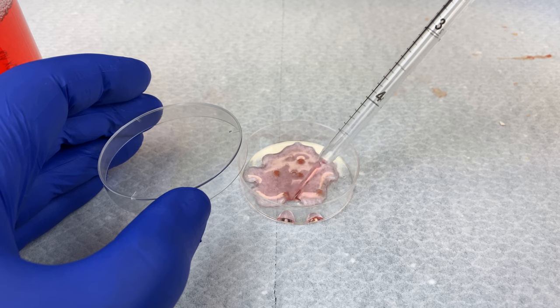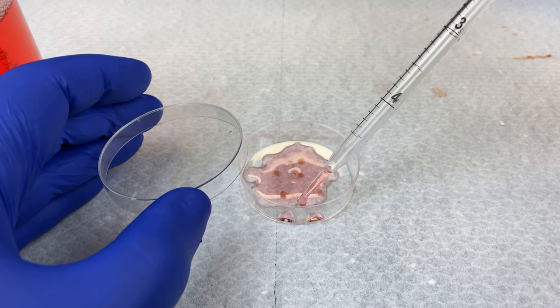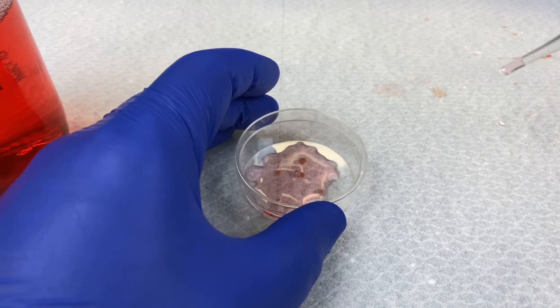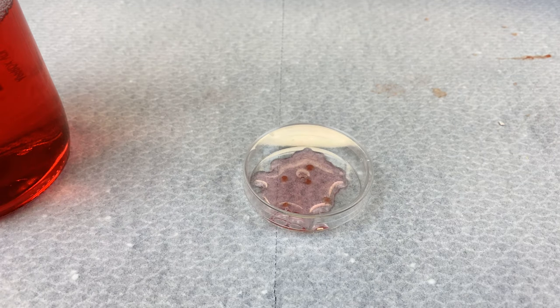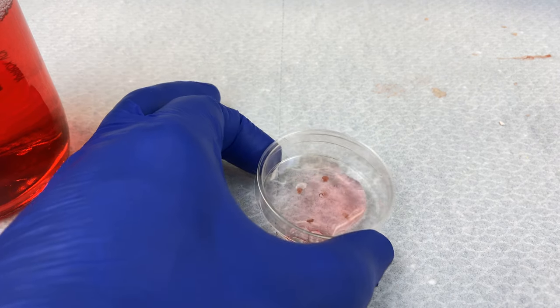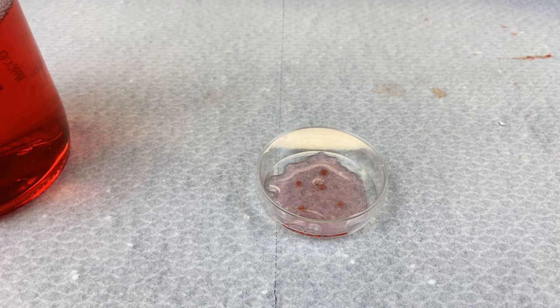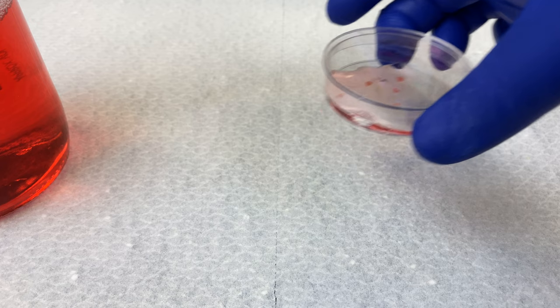It appears one of my chunks has come unadhered — that chunk will be garbage. I could remove that right now if I wanted to. It appears I have four good explants. They stuck initially and survived the addition of our MEM, staying stuck to our flask. We'll now incubate that at 37 degrees until our next lab.